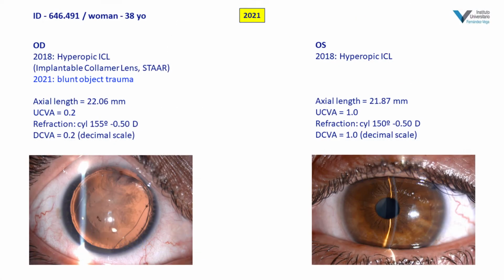The case is a 38-year-old woman who underwent surgery for hyperopia in both eyes in 2018 with a posterior chamber phakic intraocular lens, ICL Star Surgical, and who suffered trauma with a blunt object in the right eye in 2021.